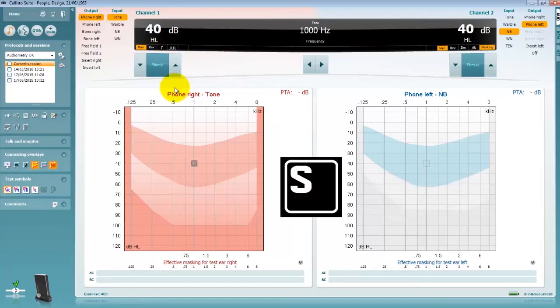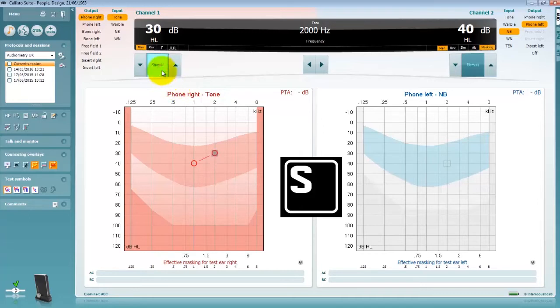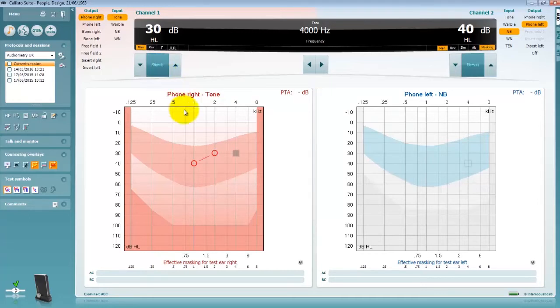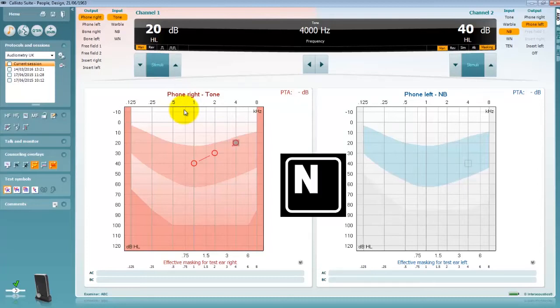To store a response you can use a left click on the stimuli icon or press the S shortcut key. To store a not heard response you can right click on the stimuli icon or press the N shortcut key.